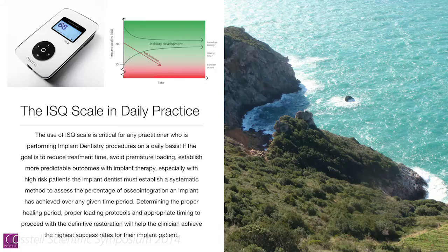If you in the audience really want to be critical as far as improving the outcomes for your patient, then you have to use some objective way to determine when that implant has achieved biologic stability.